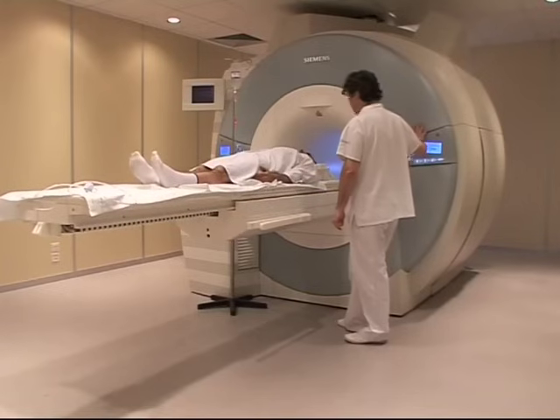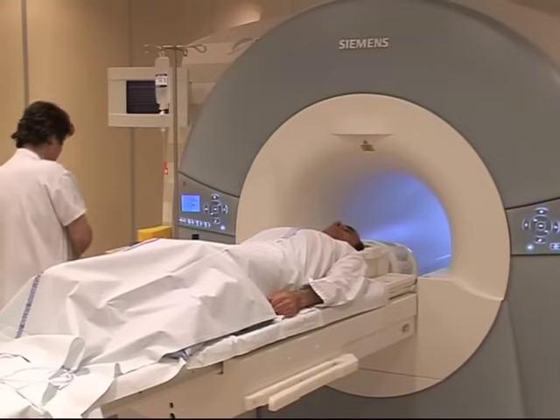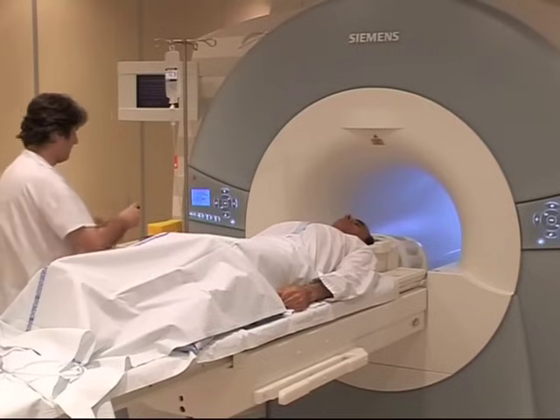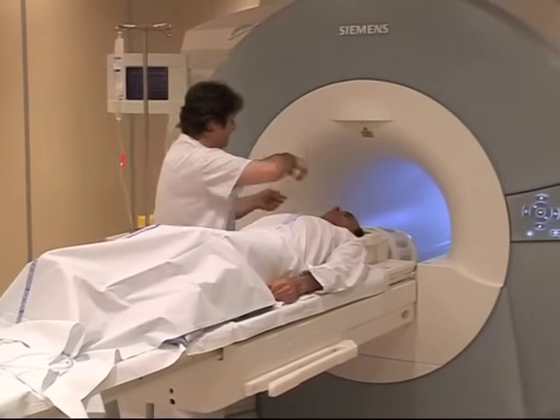The radiology technician will help you onto the examination table and give you an injection if necessary. Professionals call this placing a venous catheter, through which a substance can be injected during the scan. There is no unpleasant side effect and it enables us to observe your internal organs even better.